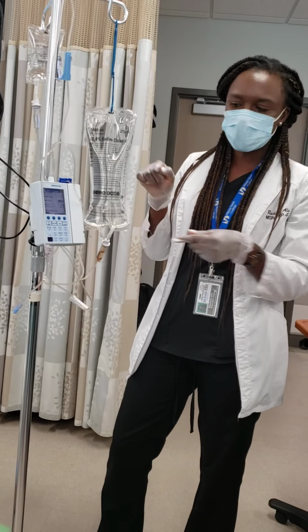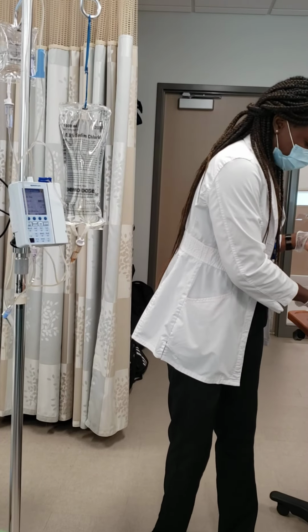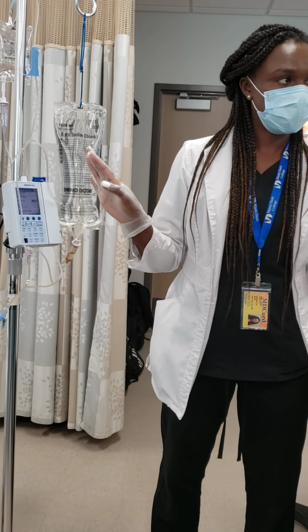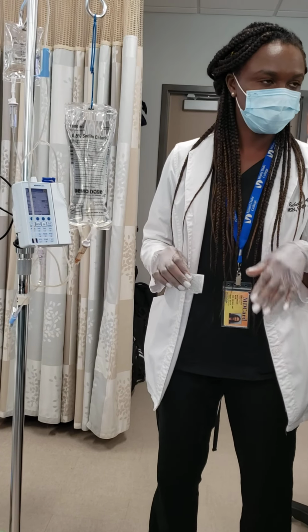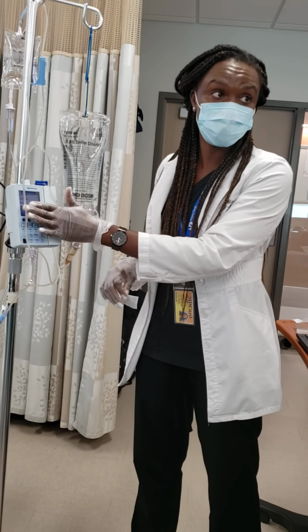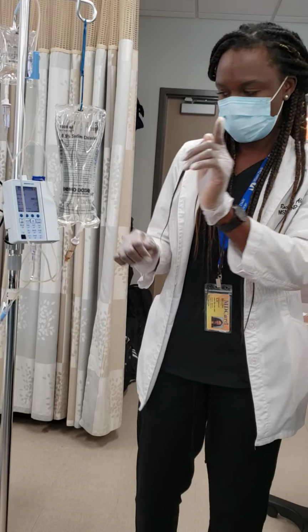It's not going to flow until you start your pump, okay? It just can't flow like that. Just as the primary causes flow, you let this open. Don't close it. You leave it open. So now the medication that is running is the primary, because you only have that program. When you finish with the primary, just start setting the secondary. Okay, so I'll show you.